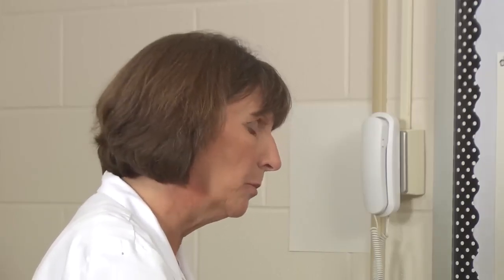Okay. I know this is a silly question, but what's an IV for? Well, you can get an IV for maintenance IV fluids, antibiotics, medications, or blood. In your case, you're getting it for maintenance IV fluids. That makes sense. He did say I was dehydrated. All right, let me go ahead and get my supplies together and wash my hands. I'll be right back to start the IV. Great. Thank you. You're welcome.